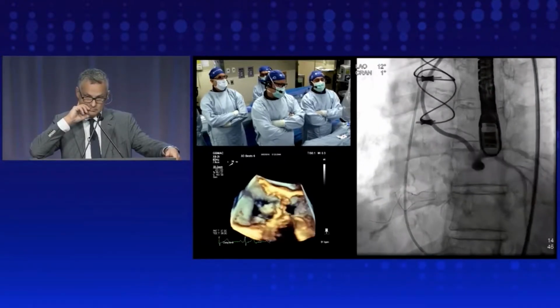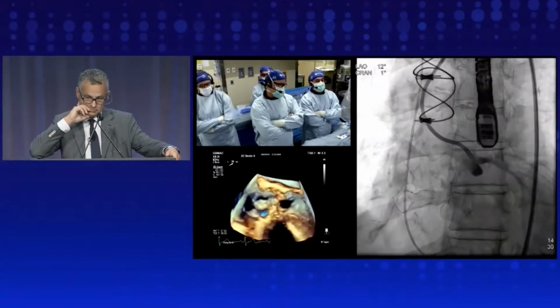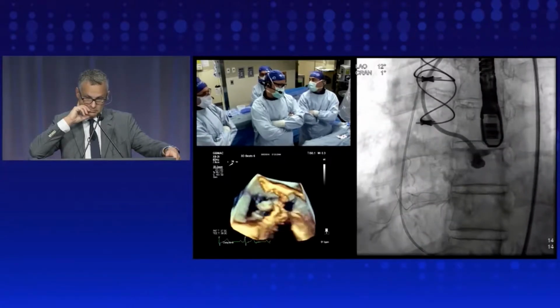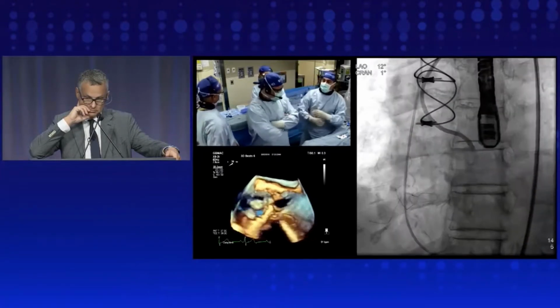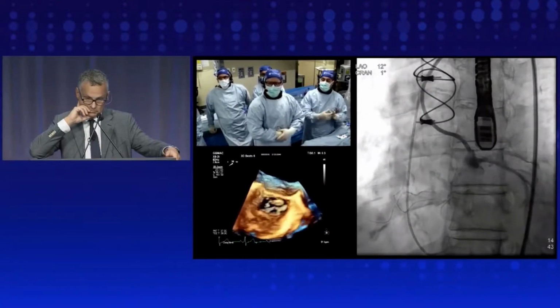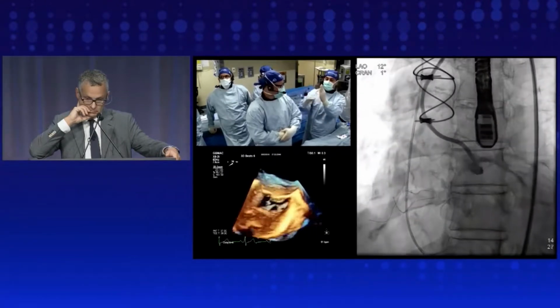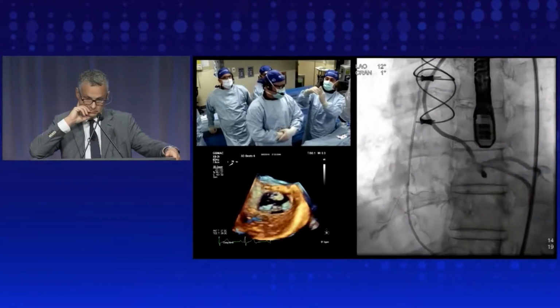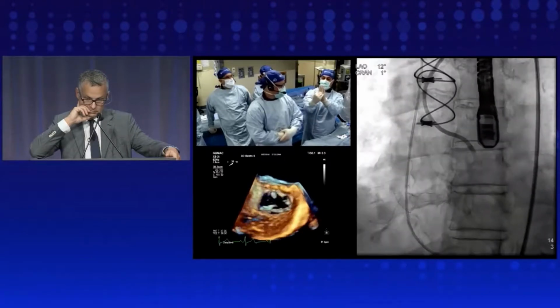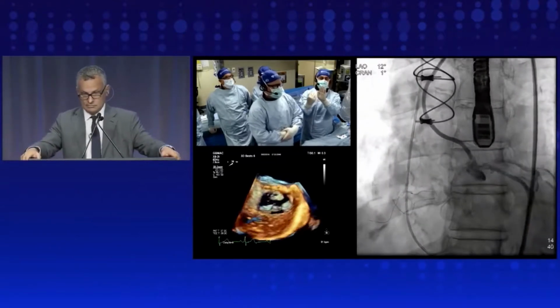Stentless valves are the most problematic surgical valves for the risk of coronary obstruction, a higher risk than externally mounted surgical valve leaflets. And basically, we have many things that we can discuss regarding the Basilica. Maybe one thing that we should describe: there are two views that we need to appreciate before we try to cross the leaflet. One view is the side view, in which we see the leaflet as a line, and we try to see the penetration angle towards it. And another one is the front view, in which we target the leaflet like that, and we want to see that we are in more or less the middle part of the leaflet, not too much to the right, not too much to the left.